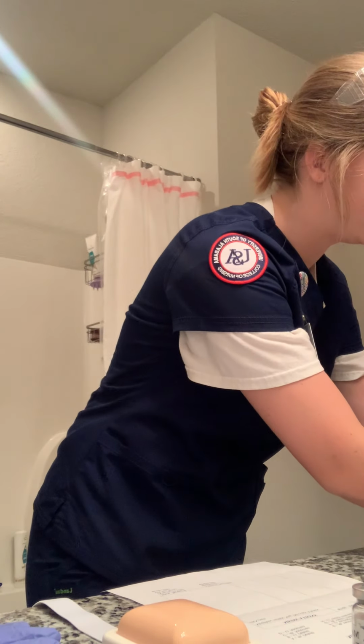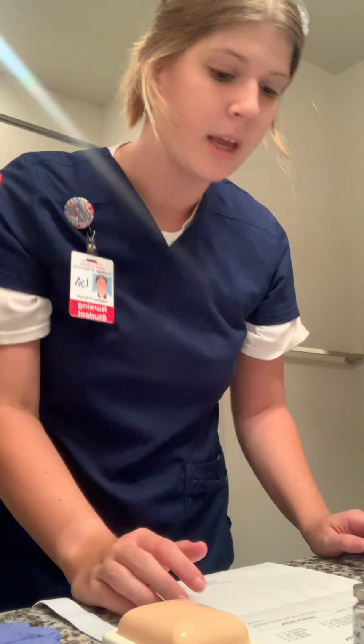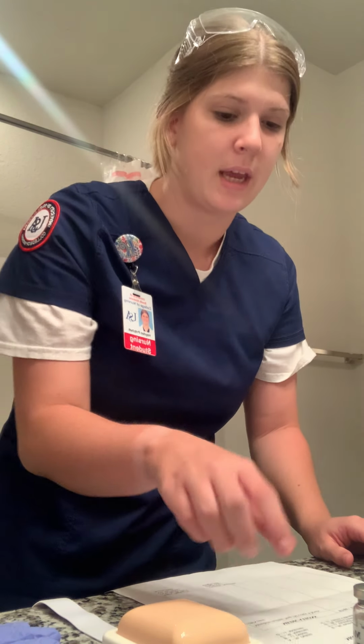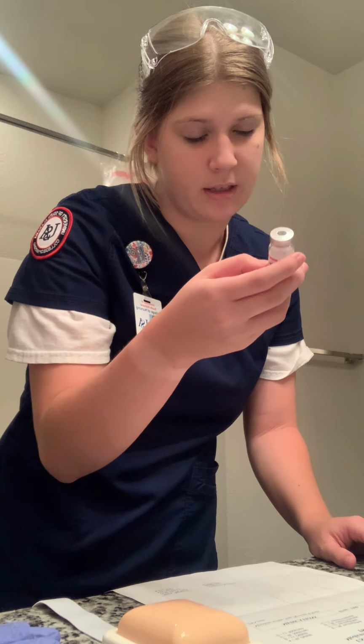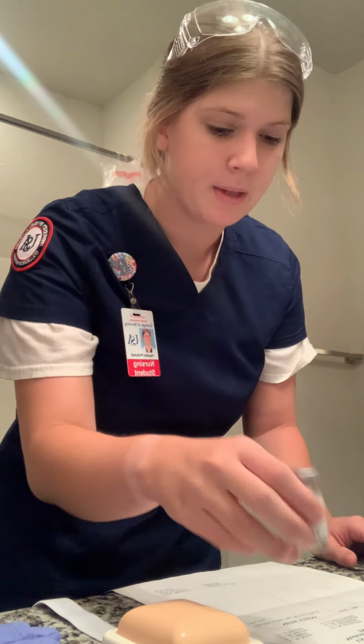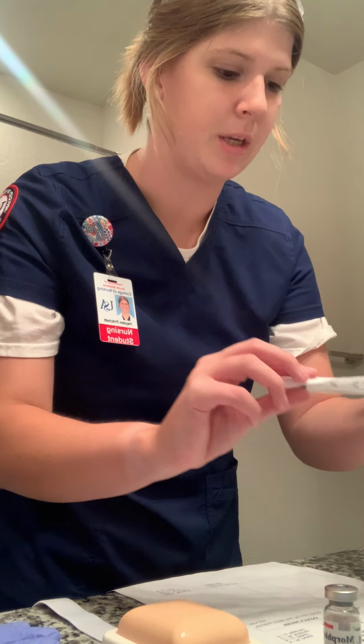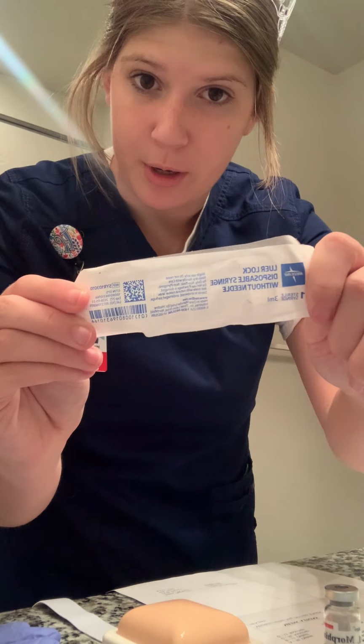I'll put my other medications over here. I won't be needing those right now. And so the morphine's correct. It's going to be at 5 milligrams, and my dosage is 10 milligrams per 1 milliliter. And since it's an intramuscular shot, I'll be using my 3 milliliter syringe.